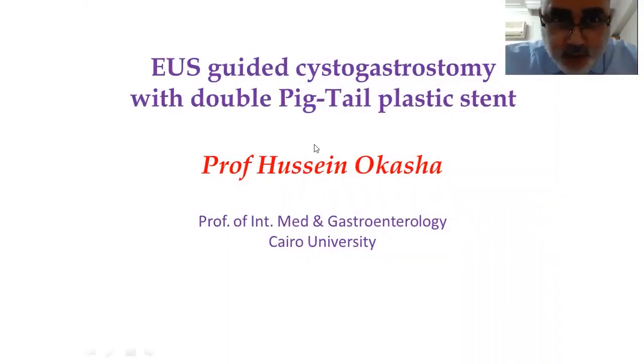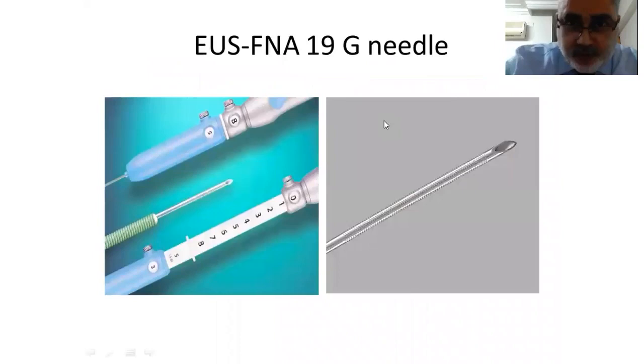In this short video, we talk about endoscopic ultrasound-guided cystogastrostomy with double pigtail plastic stent. First, we will talk about the used accessories.